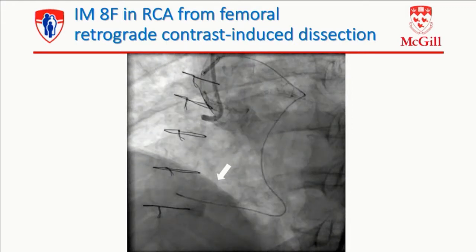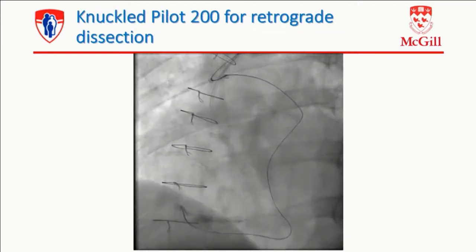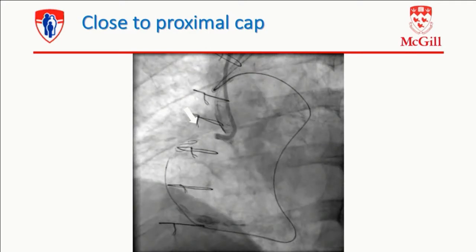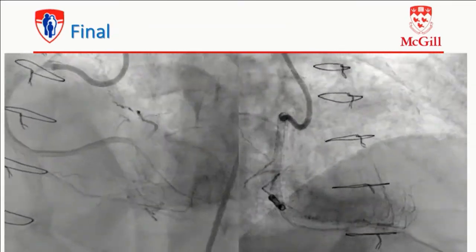And then in that case, I had difficulty starting the dissection, and I did a contrast-induced dissection, what we also call a Carlino. But now you see I have an 8 French guide antegrade because it's such a short CTO, and this guide is coming from the leg. So I have my radial in the left. I have my other left radial into the SVG, but from the leg, because I don't need my Lima anymore, I have an IMA 8 French into my right. And then we did some dissection reentry, so that's a knuckle going up. Sometimes knuckles go up quite easily. And basically, we were able to cross everything and reopen the right. That was quite big with the PL and PDA.